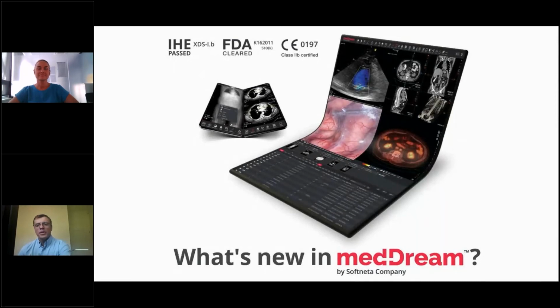Today our session will be, like always, split in two parts. First will be a presentation about new features, new information about our website. I believe today's presentation will be very informative because we will announce not only features but also some changes on our website, which I believe is critical for most of you to get more information about the MedDream, about what Softneta is doing. So I believe all this information will be very valuable.